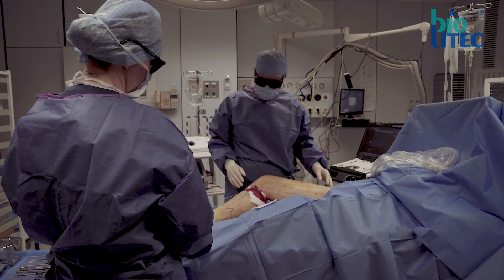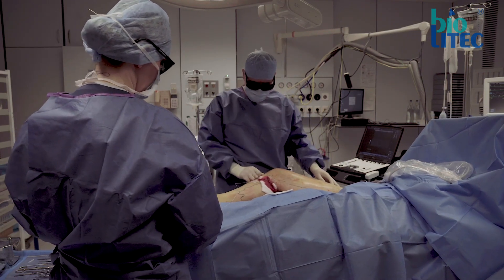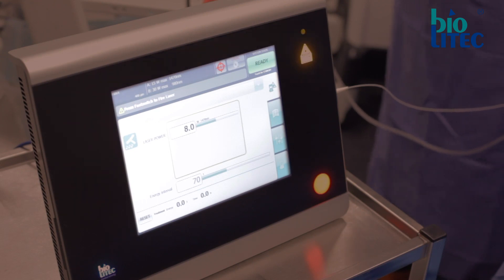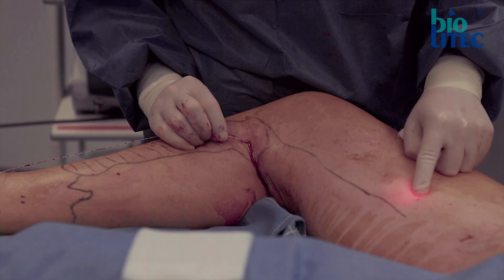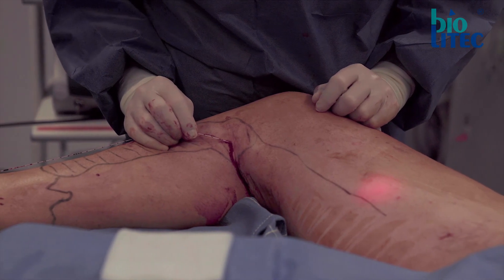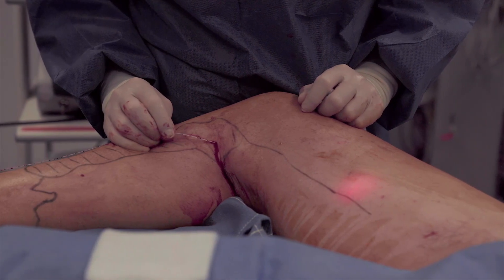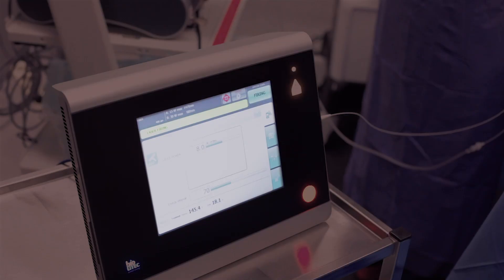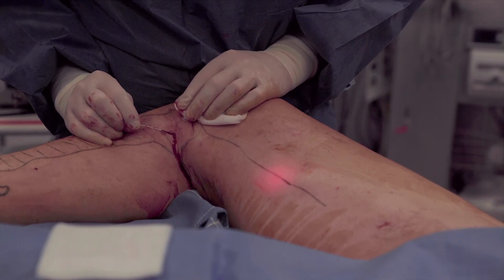Before starting the actual laser treatment, the patient is put into Trendelenburg position. As a standard power setting we use 8 Watt and 70 Joules. We perform a so-called laser crossectomy by waiting one cycle — meaning about 8 seconds — before starting to retract the fiber. Additionally, in the greater saphenous vein, we double the delivered energy for the first 10 cm by pulling back at half speed. The rest of the vein is treated by pulling back at a normal rate of one marker per acoustic signal.